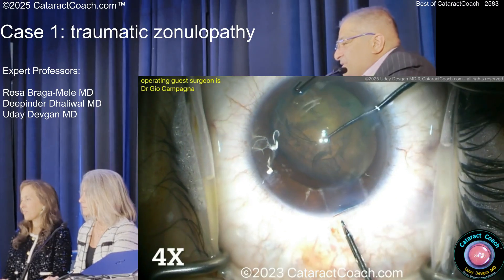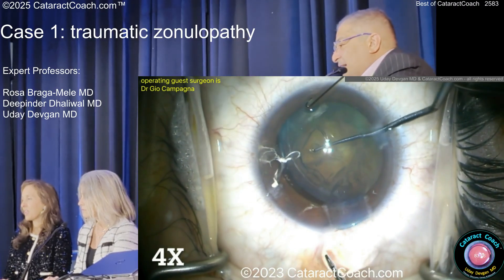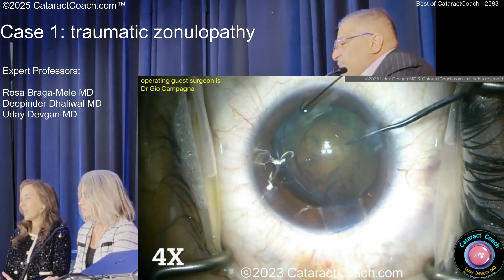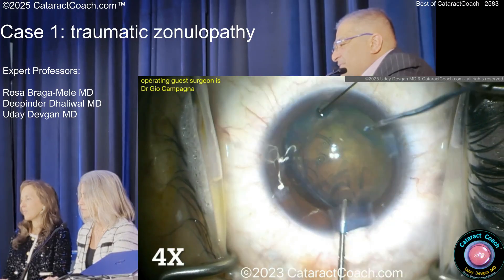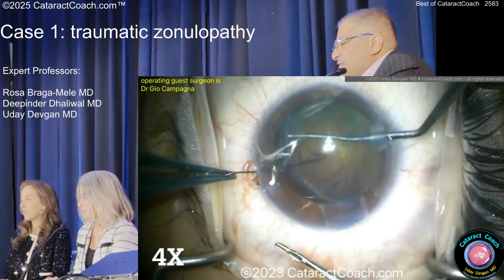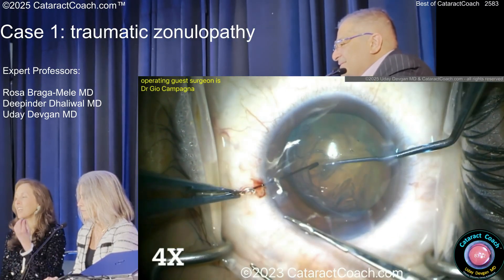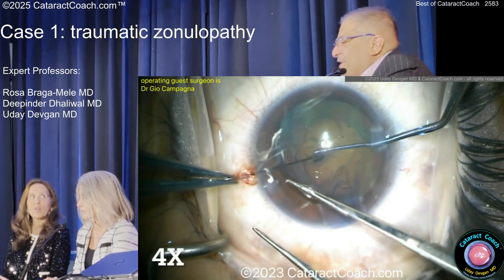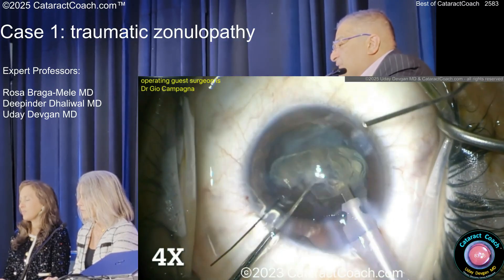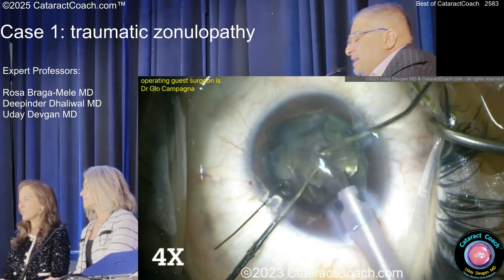Instead of hooks, here's a CTS. And now you can use an iris hook to hold that eyelet — so that can work too. But when you clean up more of that vitreous, to me it still looks like vitreous is stuck in the paracentesis. So there's the iris — just pull the vitreous out of the way, don't worry about it. The vitreous is not attached posteriorly, so it's okay, you can clean it up later. So tighten that up. Now just with the capsule tension segment — you don't have a hook, you can use the CTS, and you're going to end up using the CTS anyway.